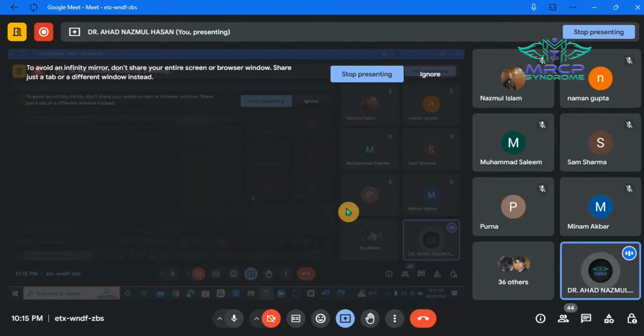And when we compare MRI and CT scan, remember two conditions: in case of acute hemorrhage and in the detection of bony injury, the CT scan is superior compared to MRI. So in case of acute hemorrhage and for the detection of bony injury, the CT scan would be superior to MRI. And both CT scan and MRI are subject to motion artifact.